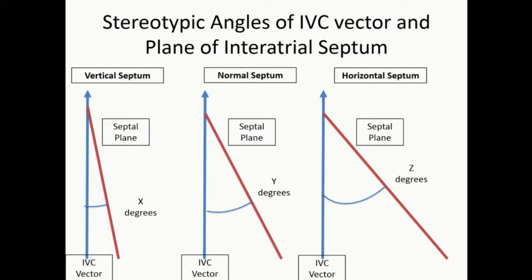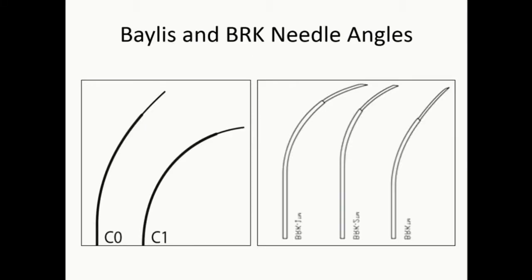And in the kind of transseptal patients we see today, there are a lot more anatomical variations. And why not start with the right needle bend for the right septal anatomy, rather than some operators who say, well, I always start with that bend, and then when it doesn't work, I reshape it or I go back. That's inefficiency. If you knew going in where you're going to puncture and what the angle was, wouldn't you be a lot better prepared?